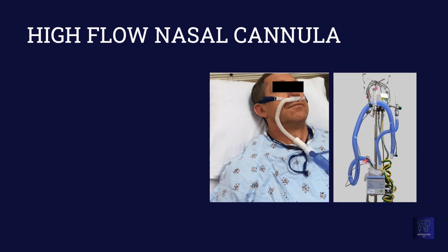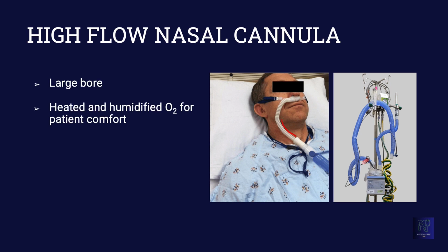We are now getting into more advanced forms of support. A high flow nasal cannula is recognized by its large bore that delivers heated and humidified oxygen to the patient. Humidification is a more efficient process at high flows, which really contributes to patient comfort. But perhaps the biggest advantage of this device is its ability to generate high flows. You can reach flows up to 60 liters per minute.